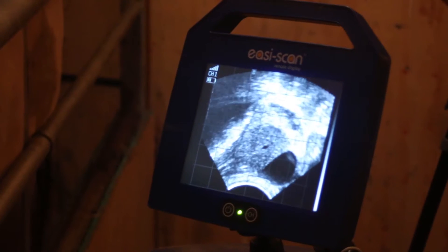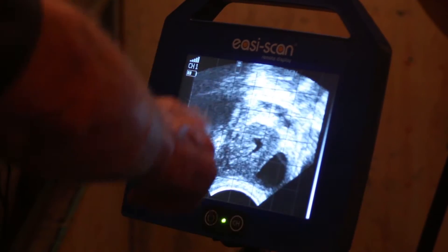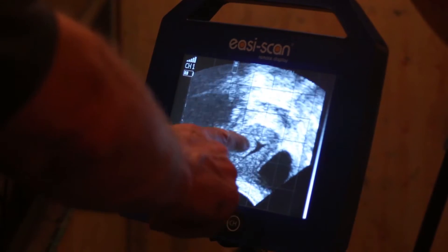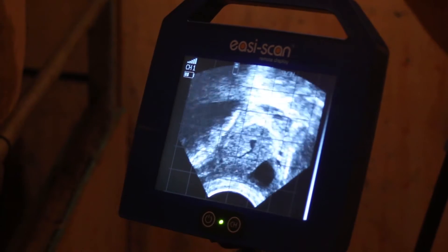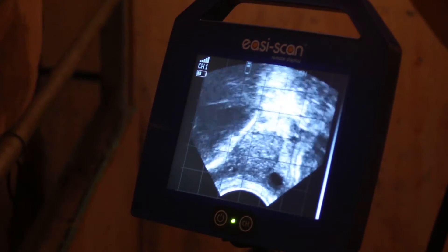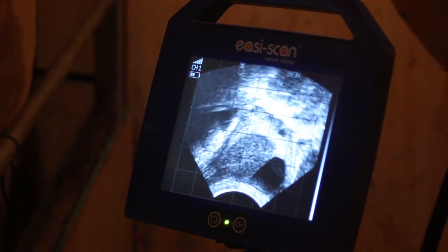I've just grasped hold of the left ovary and on the screen in front of me the whole thing is the ovary. Clearly we have in the centre of the ovary a nice corpus luteum with a central lacuna or cavity or hole which is fluid filled, and then we can see various follicles around the ovary. You can see a nice big follicular structure here and then several smaller follicles running around the periphery of the ovary.